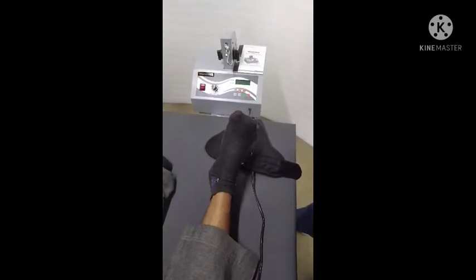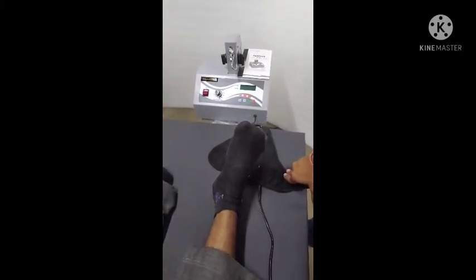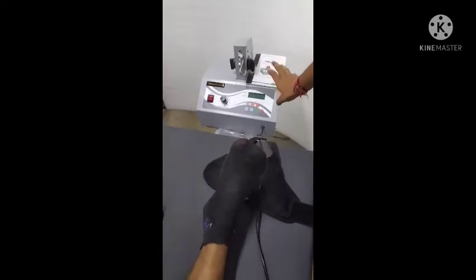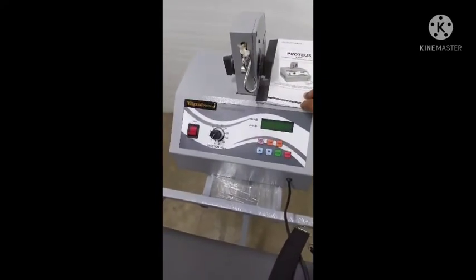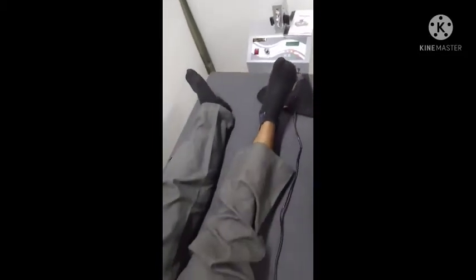Hello everyone, we are from Tapsi Electromedical System and Services. In this video, we are going to represent how to give ankle traction. So this is the computerized lumbar cervical ankle traction unit, and this is the traction table. And here is a patient.